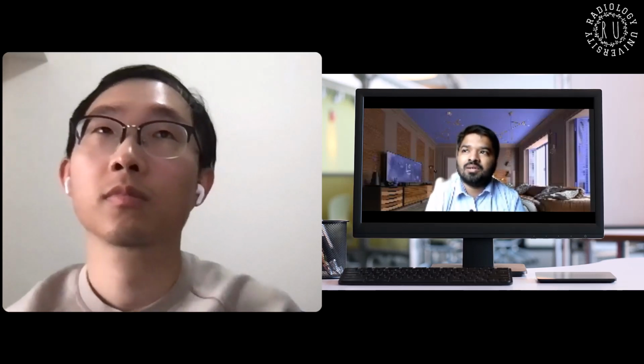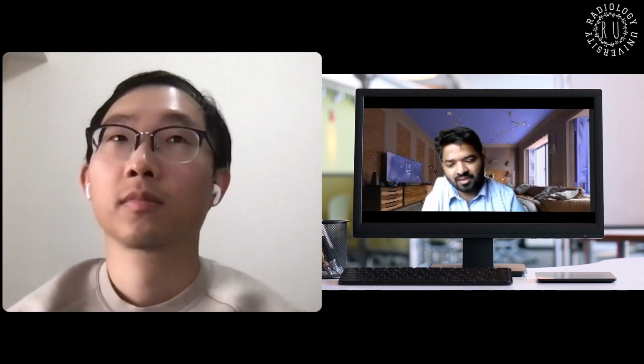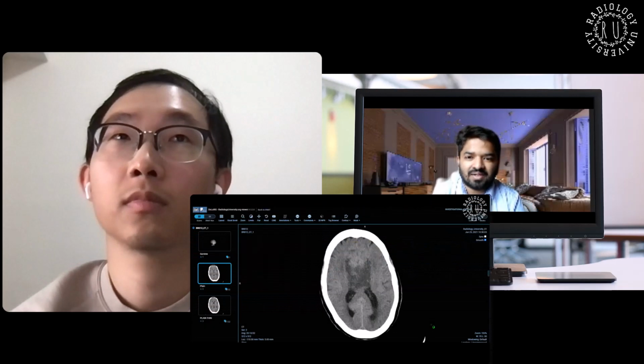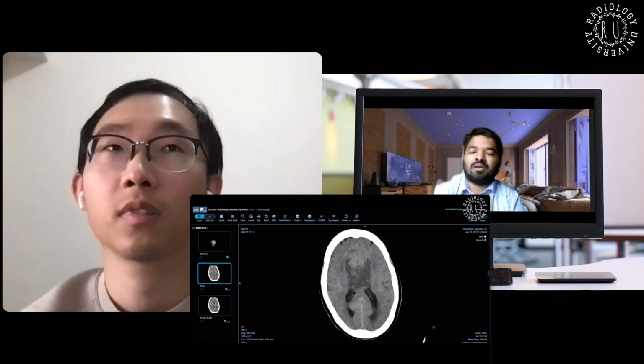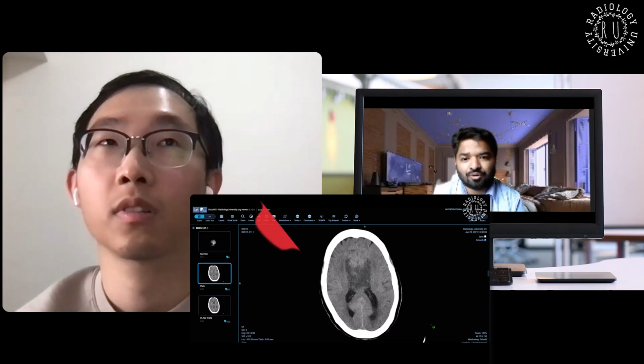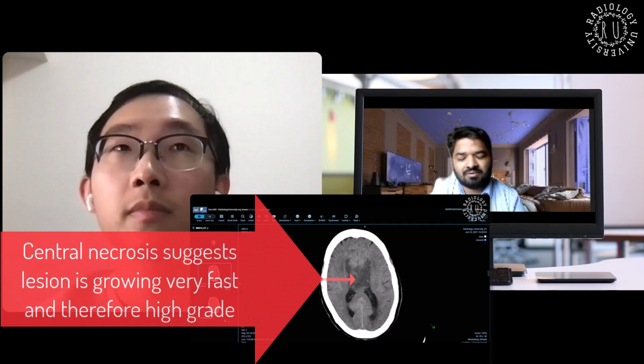And also you did well about that case. The previous case, you hit it out of the park. It was a midline lesion crossing the midline. You could also have mentioned there was a central necrosis and things like that within it. But otherwise, well done. Good job. Thank you. Thank you. Keep it up.